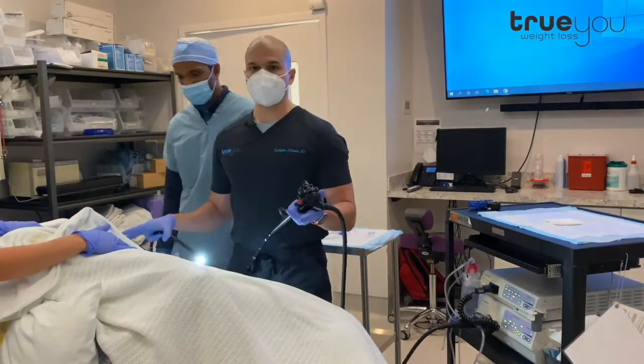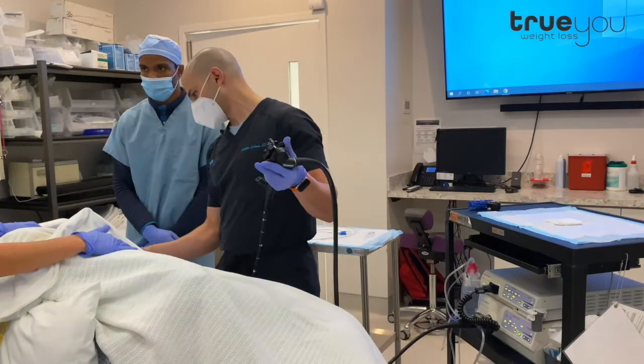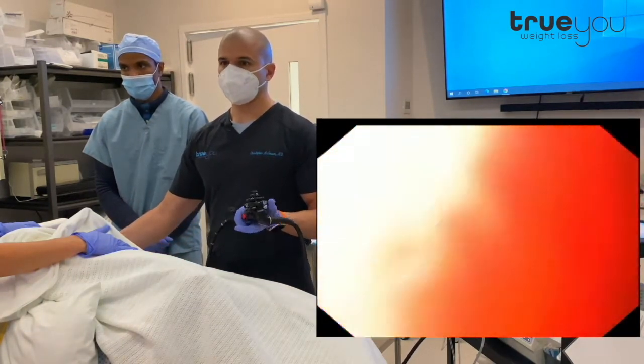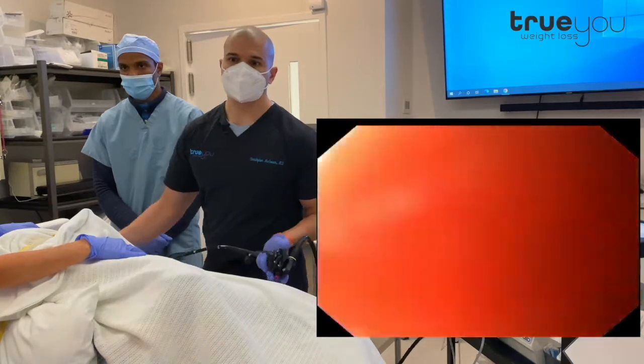She has been on a clear liquid diet for a couple of days, so the stomach is completely empty. We're going to go down with our endoscope and take a look. She's under a twilight sedation — propofol — to keep her comfortable. This whole procedure is going to take about five minutes. It's very fast.